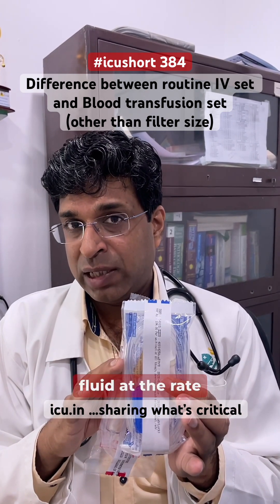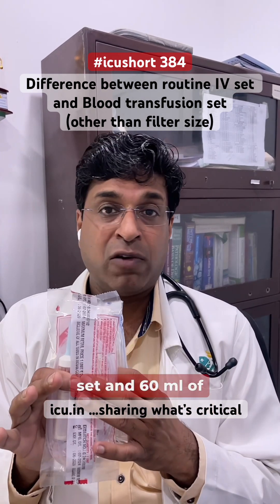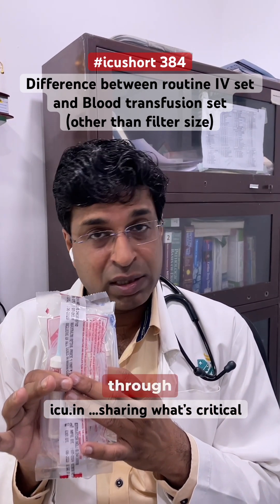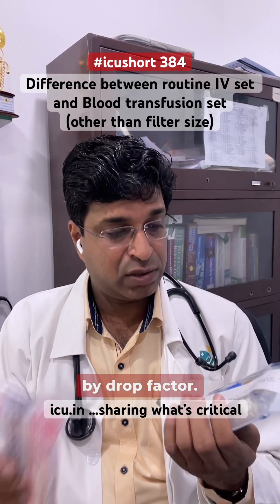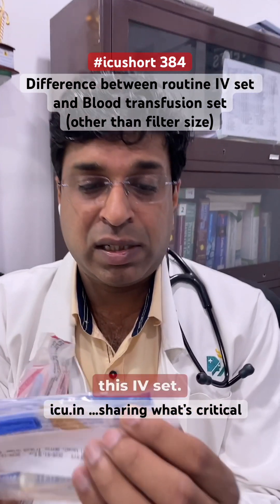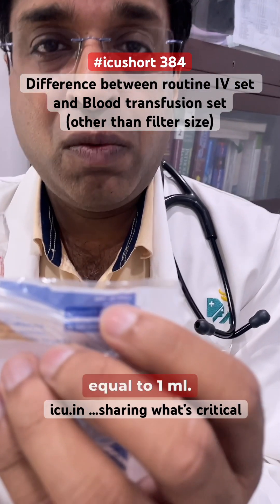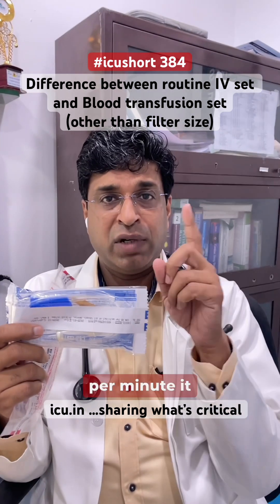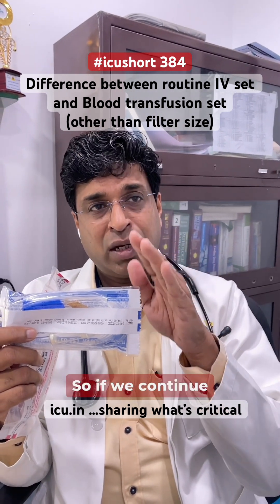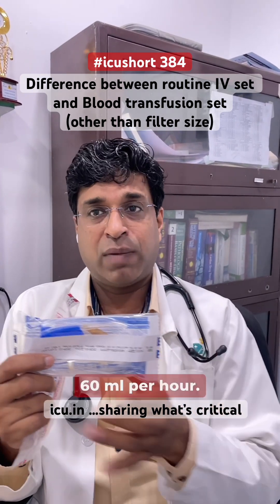Suppose we need to transfuse fluid at 60 ml per hour from this IV infusion set. We calculate by drop factor, which is written on the IV set — here it is 20 drops per minute equal to 1 ml. So if we give 20 drops per minute, that equals 60 ml per hour.